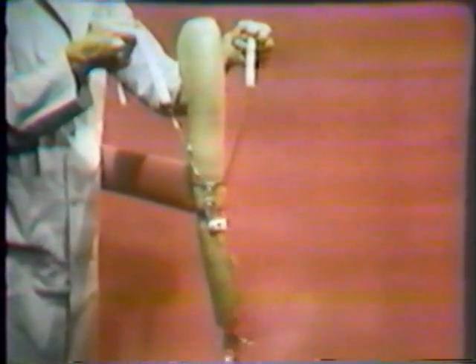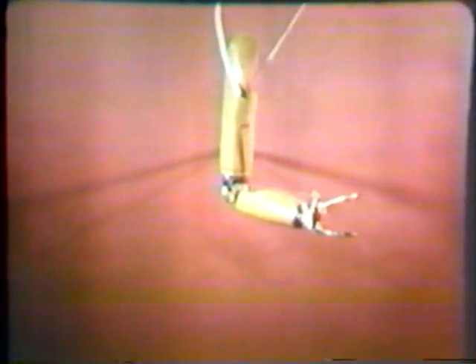To summarize the mechanics of the above-elbow control system: tension on the elbow-flexion terminal device cable flexes the elbow; the elbow is locked; the terminal device is operated; the elbow is unlocked; and the elbow is allowed to extend. The full sequence is elbow flexion, elbow lock, terminal device operation, elbow unlock, and forearm lowering.